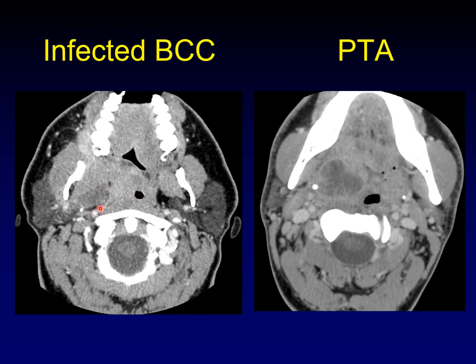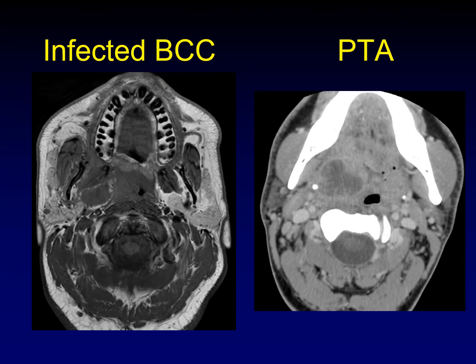So that's the difference between an infected second branchial cleft cyst and a complex peritonsillar abscess. The key finding to making this diagnosis is this rim of fat all the way around the infected cyst. If this were a peritonsillar abscess or extension of a peritonsillar abscess, this fat would not be here between the tonsil and the cyst.